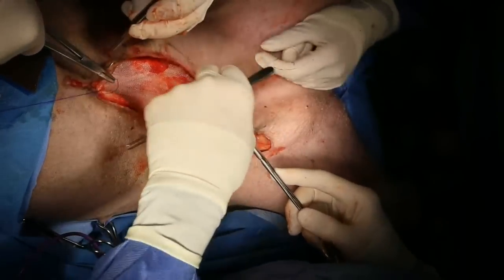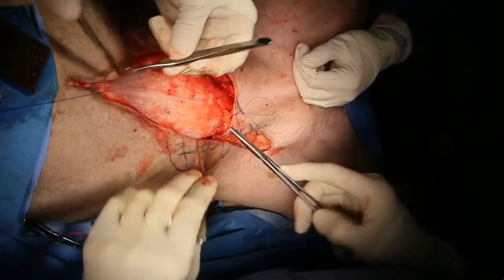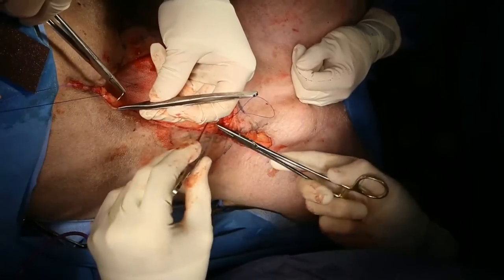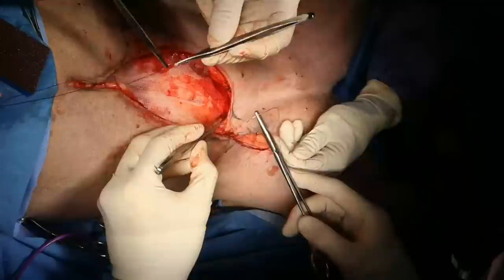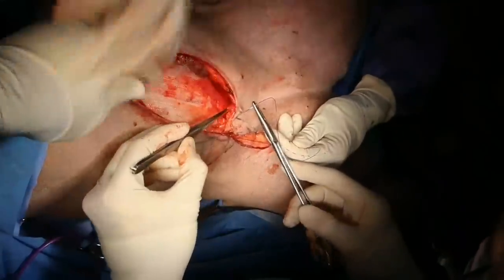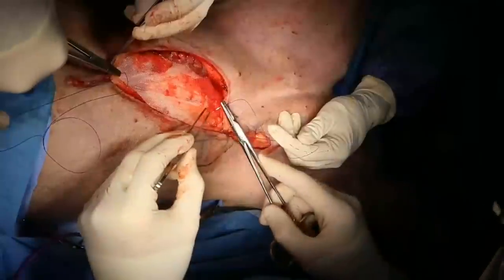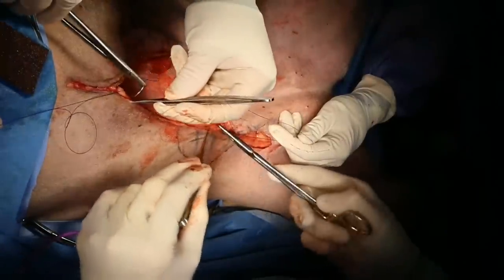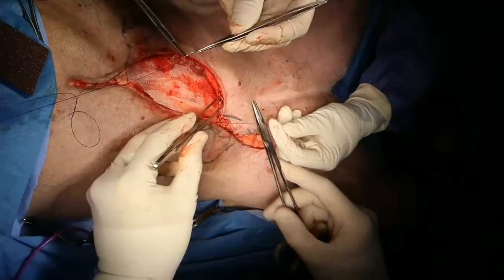You might be tugging on that yet. Mel is trying to make my job harder. Somebody's going to slow you down. It's very visual from the overhead camera how much faster you're making your closure look. When I was at CSU, I used to bet the students that if I could finish my suture line before they started their first knot, they had to buy me a slab of beer. And I won a few times.